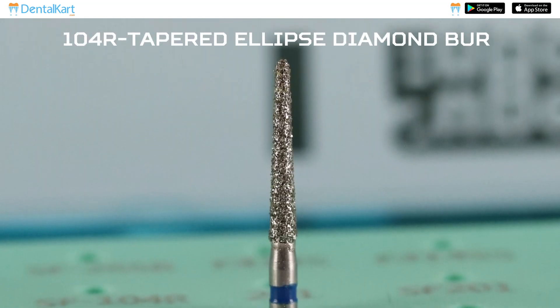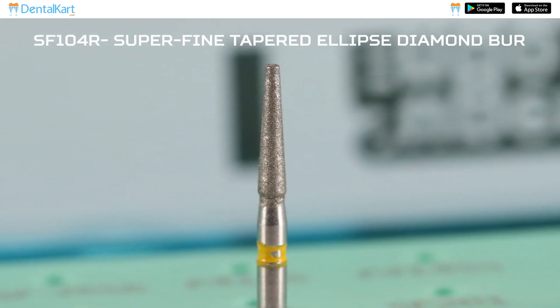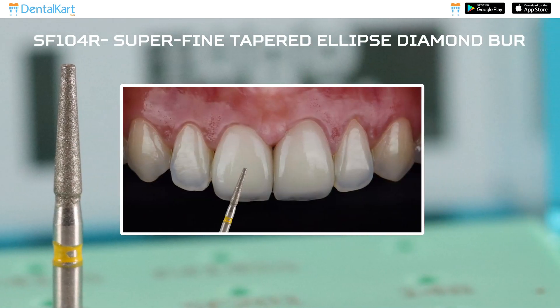3-2 R Tapered Ellipse Diamond Burr: This is used for creating regular chamfer margins for metal crowns. 3-2 R SF 104 R Super Fine Tapered Ellipse Diamond Burr: This is used for finishing and polishing.